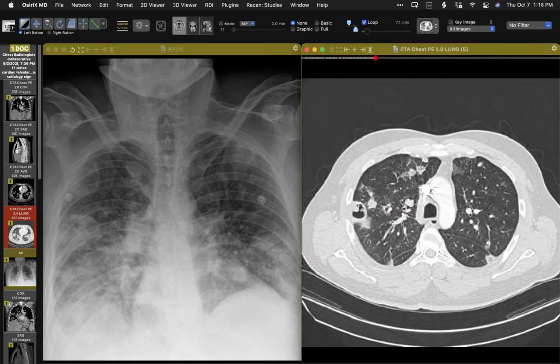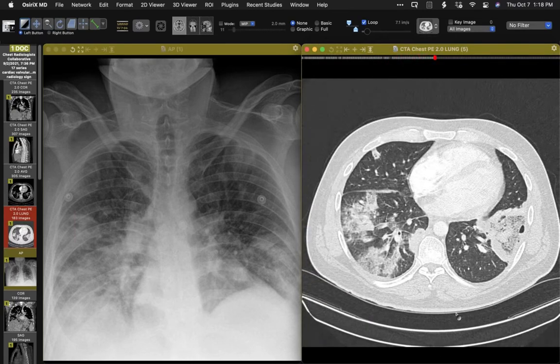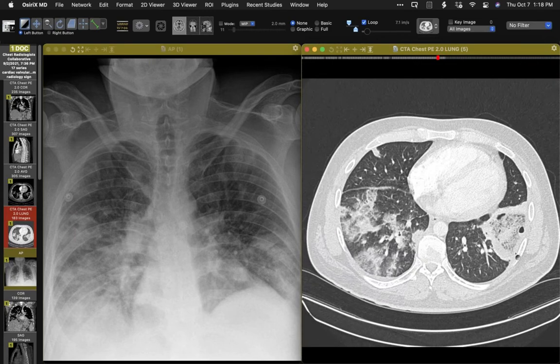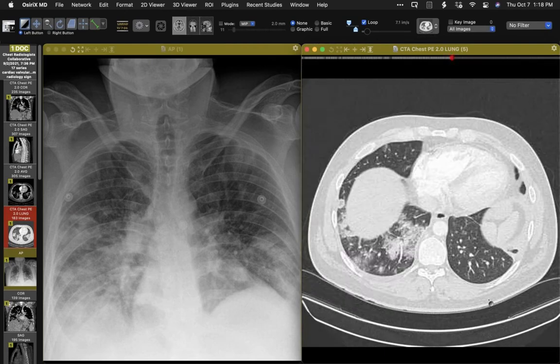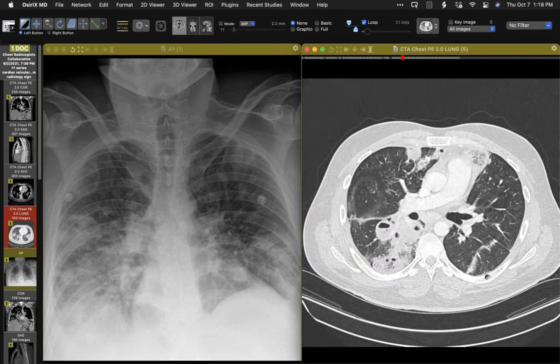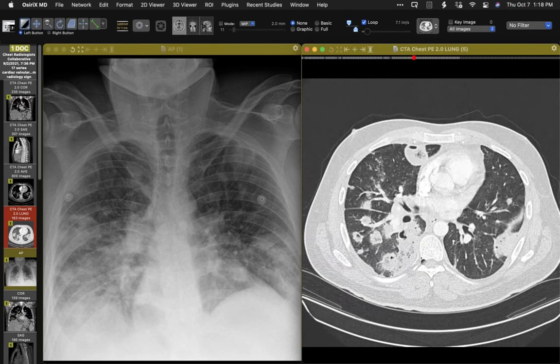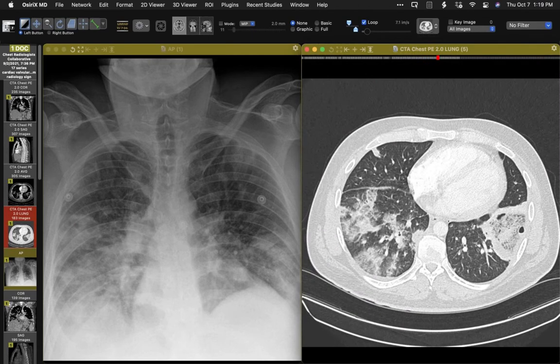And in fact, as you can see here, extensive areas of cavitation. But even more than that, particularly for this relatively large lesion, we have a classic bird's nest sign, an extreme reverse halo sign that we at least associate in the oncologic context with immunosuppression and mucor. But a lot of the others have very similar findings. So multifocal opacities with extensive internal necrosis, bird's nest sign.